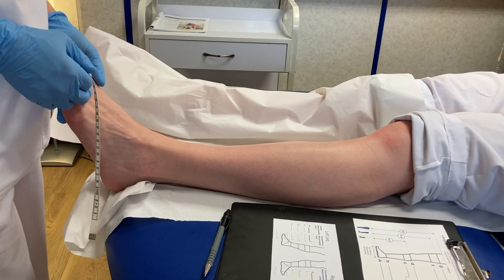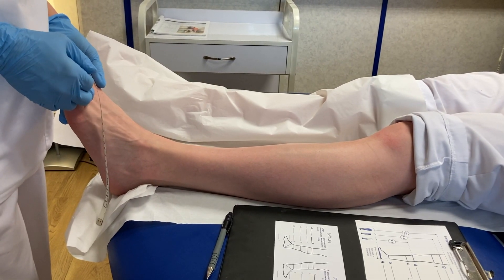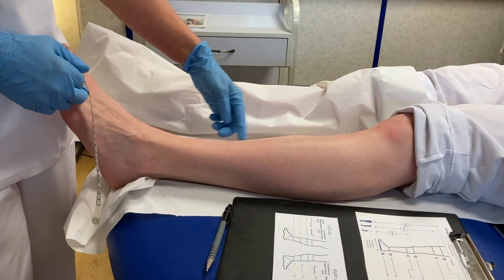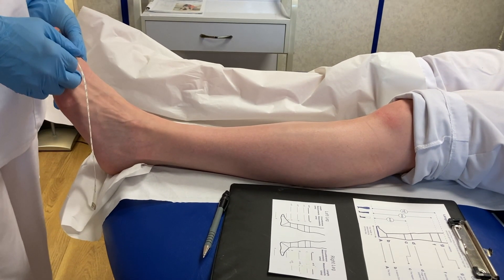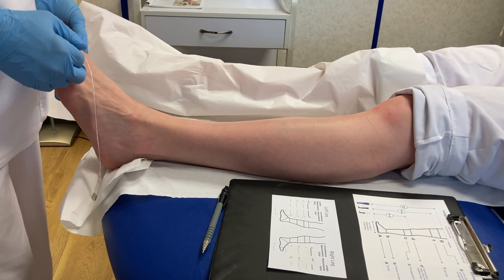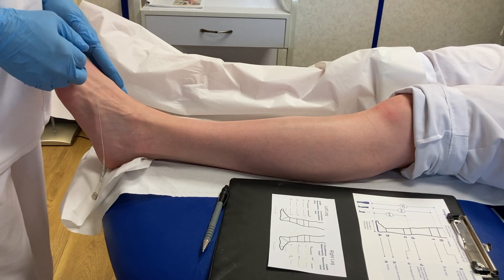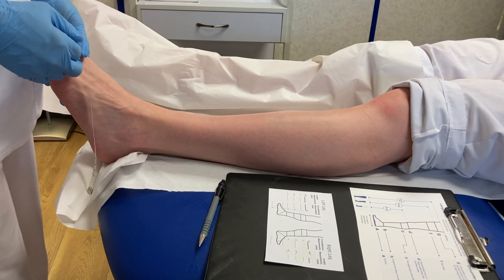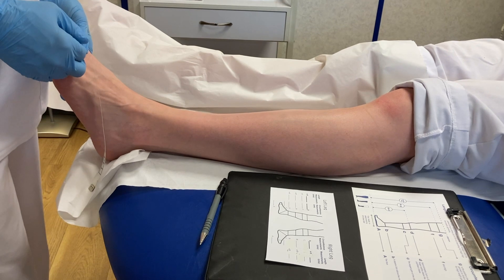This patient is presented with an intermittent swelling of her below-knee, mainly as a result of having venous grafting on her leg. In order to prevent that, a compression garment below knee is the treatment of choice.